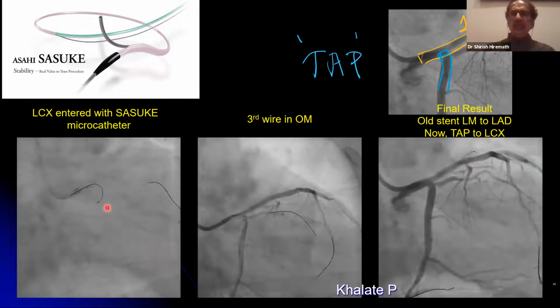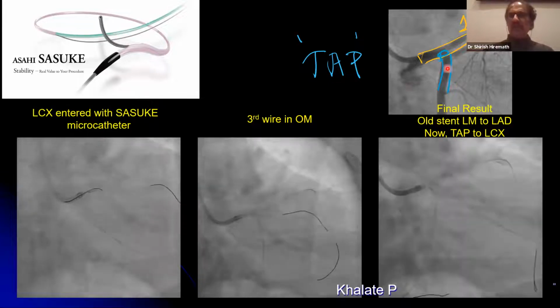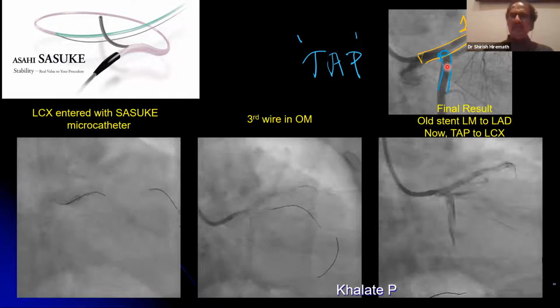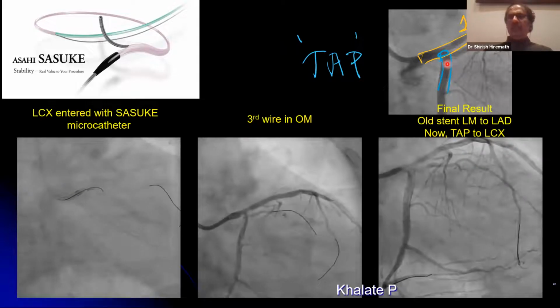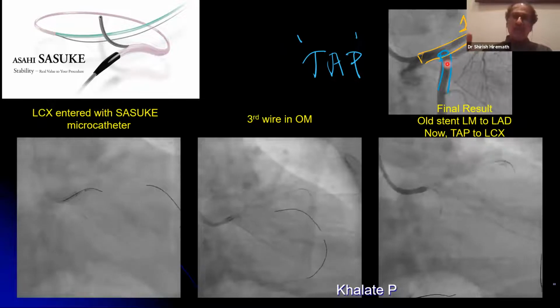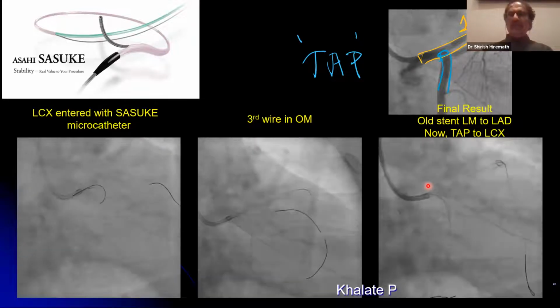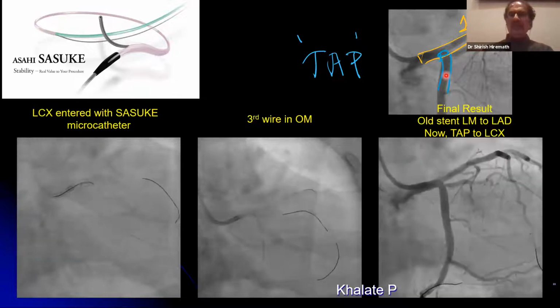And then you do a T and protrusion in this case. So you prepare the bed with a regular balloon, a non-compliant balloon, a cutting balloon, whichever way you want. But I would be very aggressive on this because circumflex ostium is very notorious for re-narrowing. As it is, we're addressing an ISR on the side of the first stent, and this is why we used everything and then put a stent as T and protrusion.